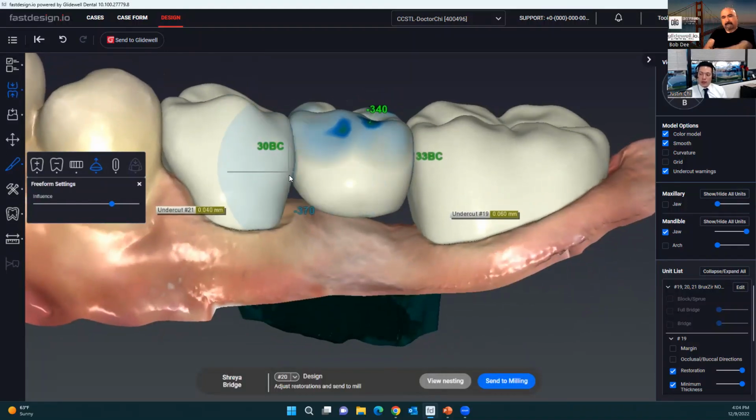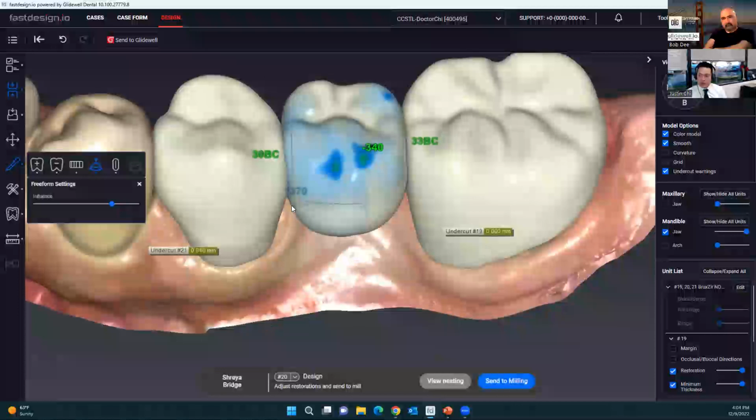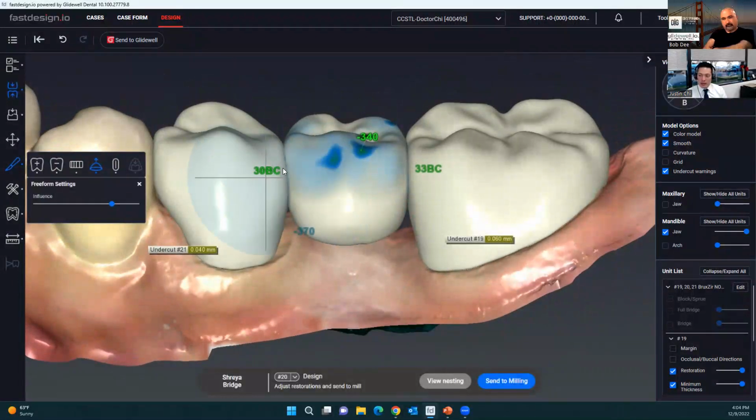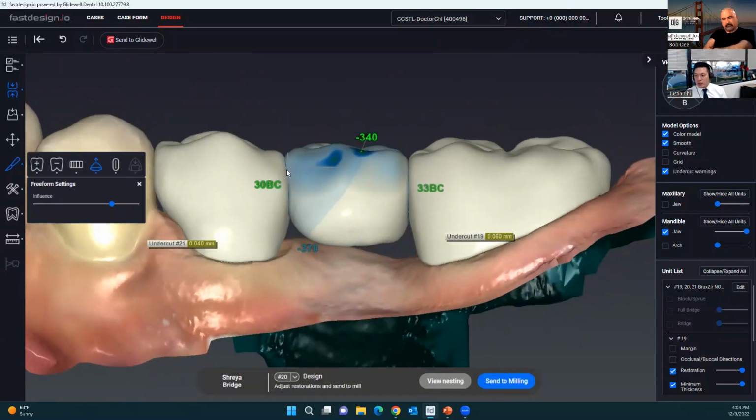And so one of the things that we do to ensure that high toughness at the connector area is this connector calculation. So as long as we hit the 27, it's the product of that formula I mentioned, the height of the connector by the buccal to lingual width. As long as we're in that green zone, there's plenty of thickness, mainly from cervical to occlusal.